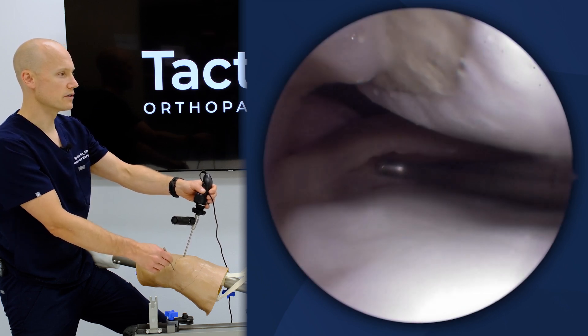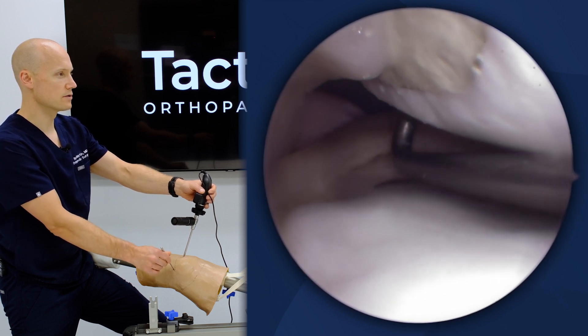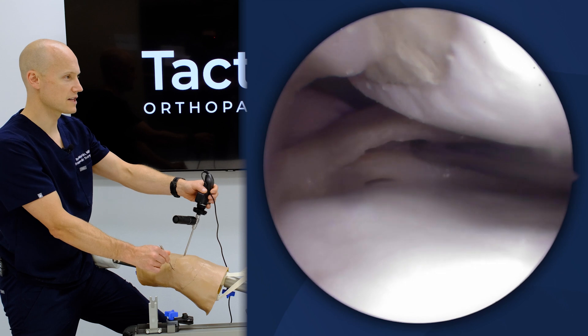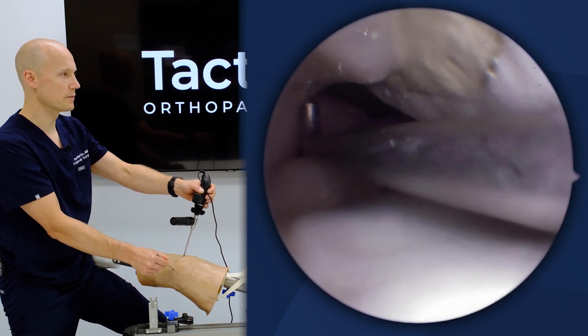You can see here that the knees are built with a horizontal cleavage tear to gain access to the examination and probing of different aspects of the meniscus. You can see the superior leaf of the meniscus, and I'm probing the inferior leaf.